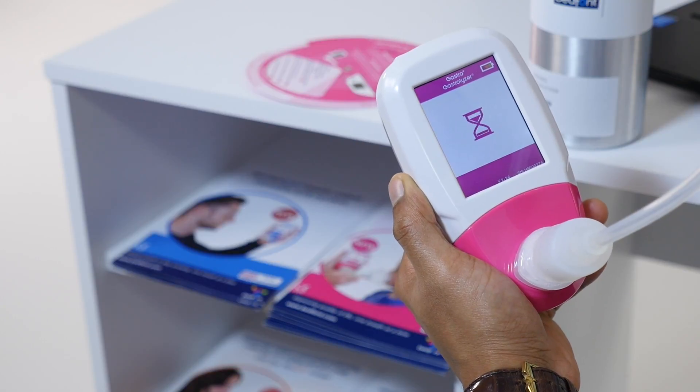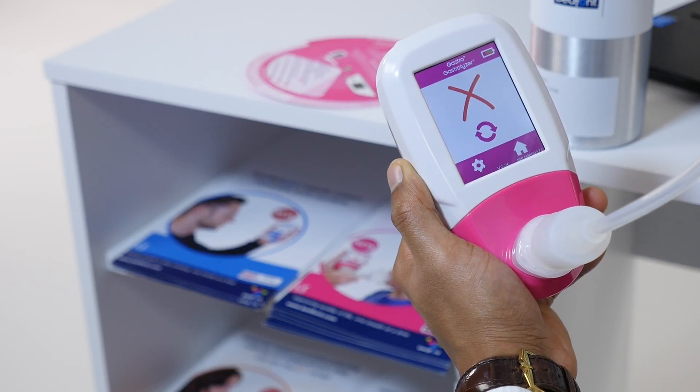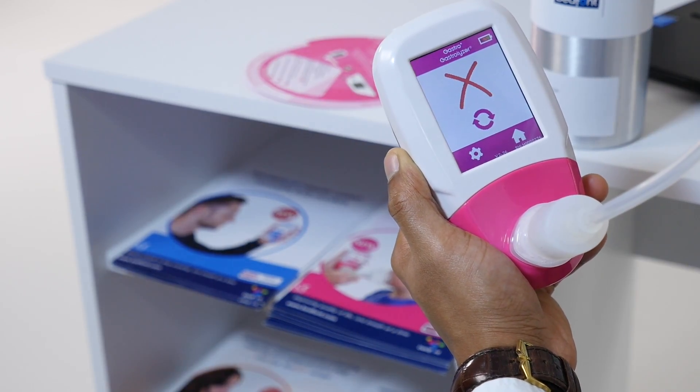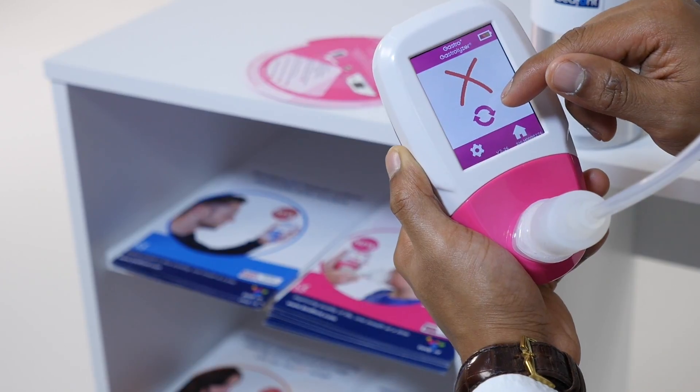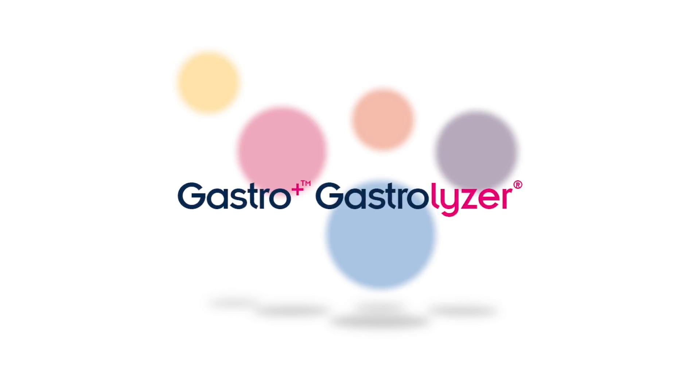If calibration has failed, a red cross will be shown on screen. Press the retry icon to re-attempt calibration. If this problem persists, please see the troubleshooting section of the manual or call your local supplier of Bedfont products.